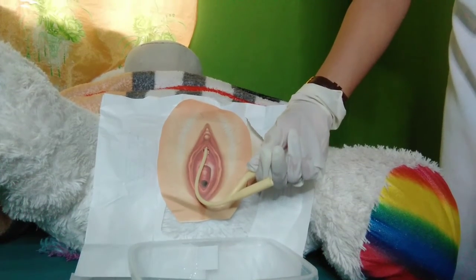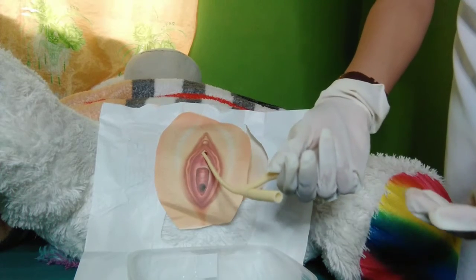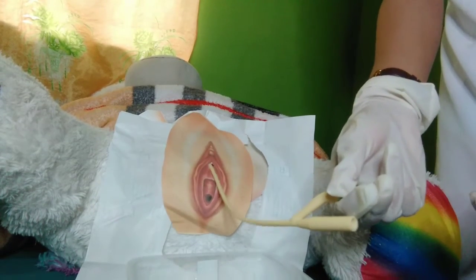So after the balloon is inflated, pull gently on the catheter until resistance is felt, and then advance the catheter again.